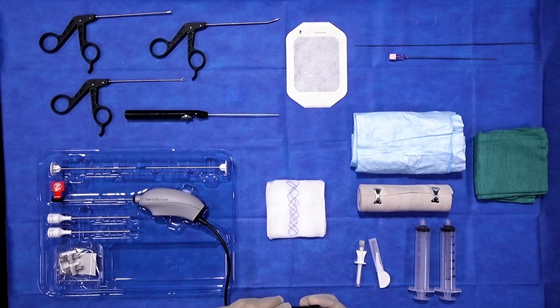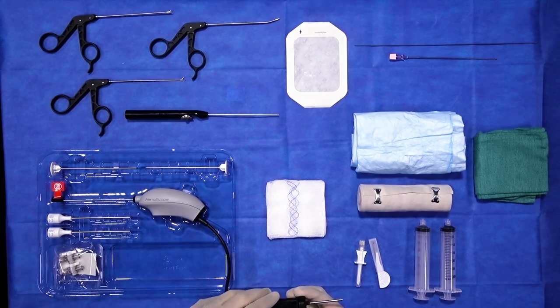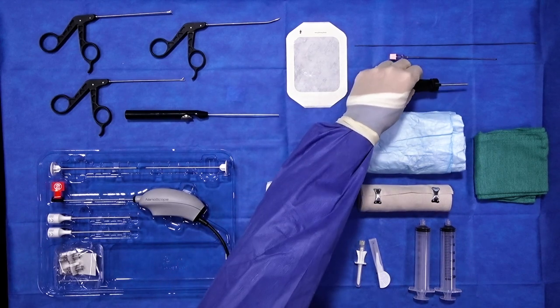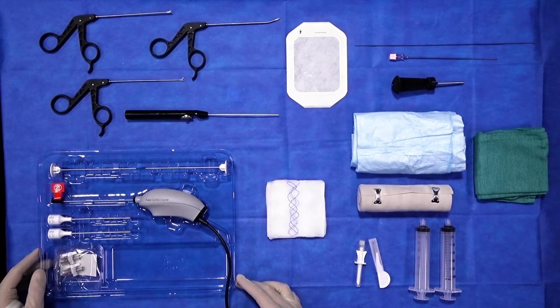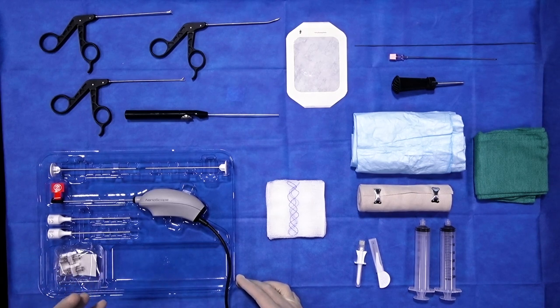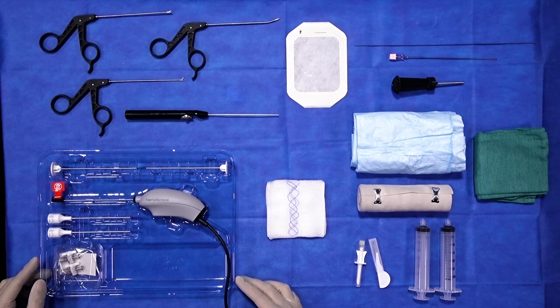The nanoscope itself is a 1.9 millimeter camera with an outer 2.2 millimeter sheath. That is about a third of the size of the routine instrumentation that we're currently using, and that of course offers several advantages. Number one, first and foremost, minimal trauma to the soft tissue, but also an ability to access pathology and see things in the knee joint without iatrogenic injury to the cartilage in ways that we've never been able to before.